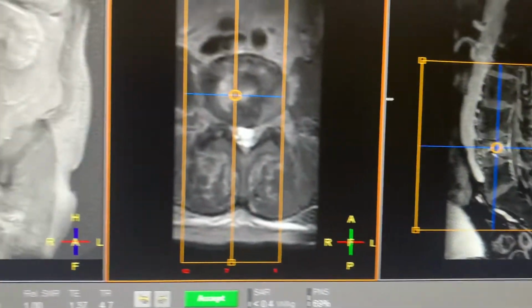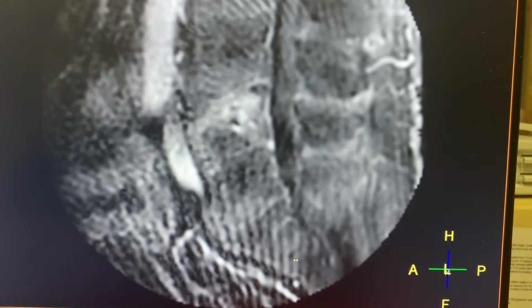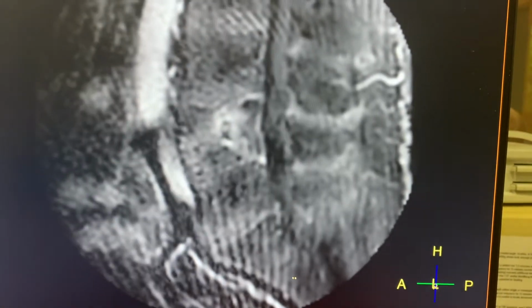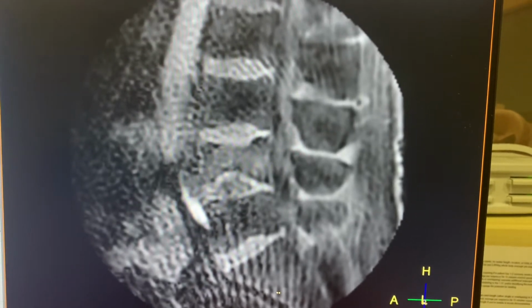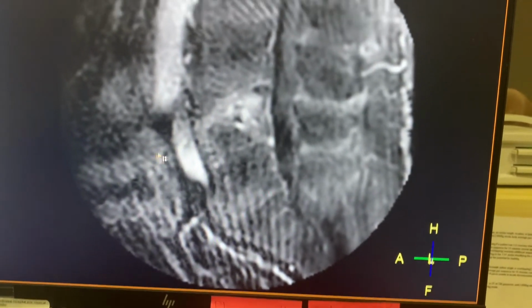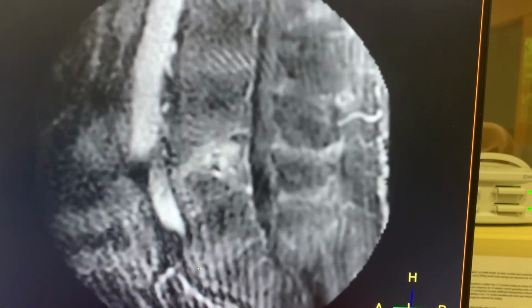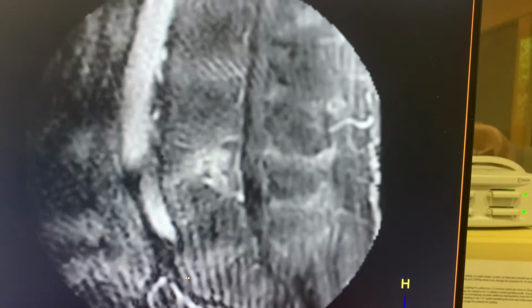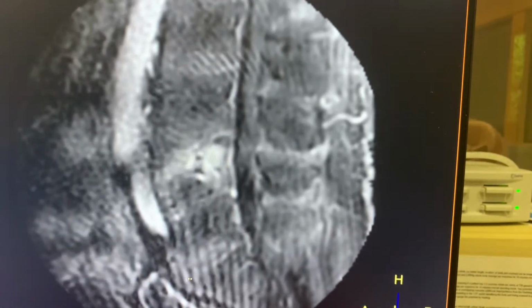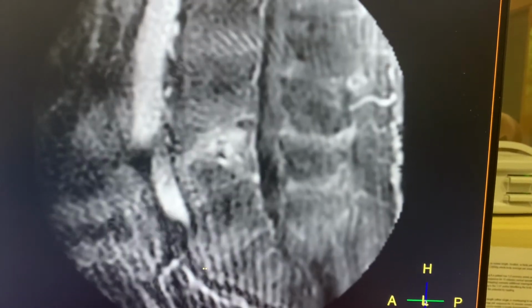This is how the final product is going to look, with 15 phases of enhancement that you can see. It's important to center your vertebra right in the middle, because you can see I've got some artifact, and that was from metal. My patient had metal in the spine, inferiorly and superiorly. You may not have artifact, but I did.